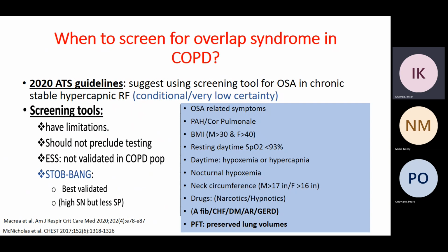And I'll tell you exactly the mode that you need to use. But in the meantime, you need to figure out their sleep apnea component, because in these studies that I presented to you, they were using a default PEEP of 5 because there's no sleep apnea.